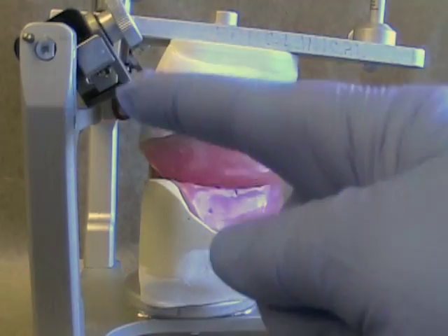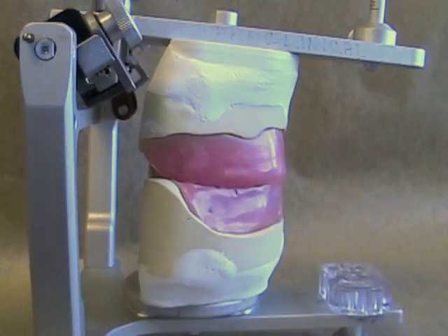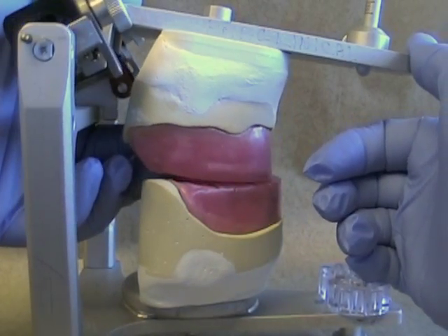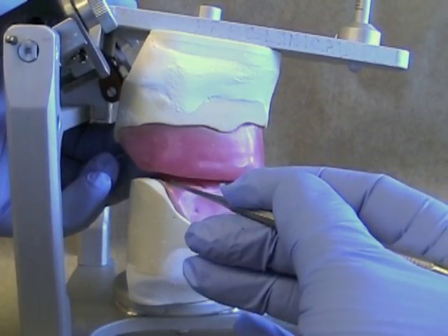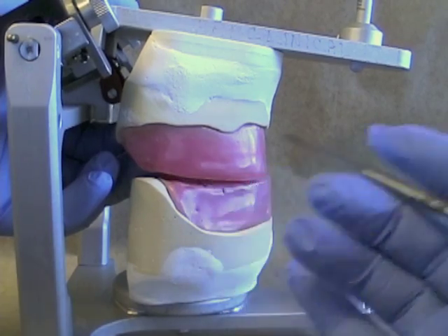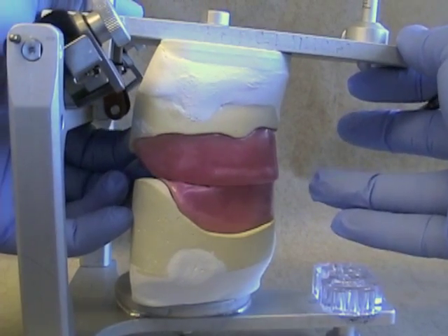Let's start with a very steep condylar angulation. Notice how steep the angle is, and notice that the occlusal rims are initially in contact as we push the maxilla backwards on the articulator. Notice the separation that occurs at the very back of the rims. This is the same as the mandible protruding in the patient.